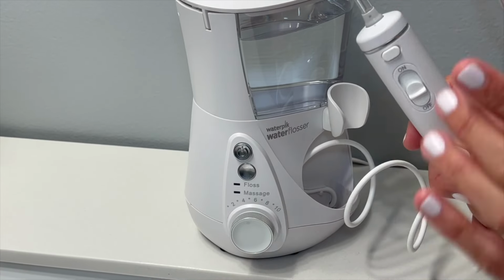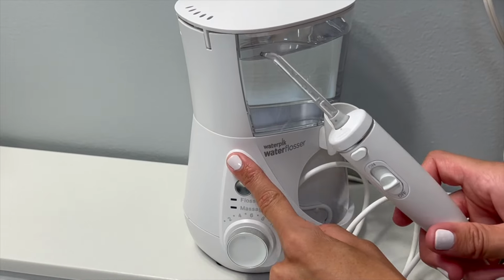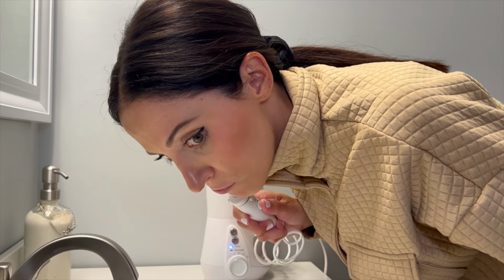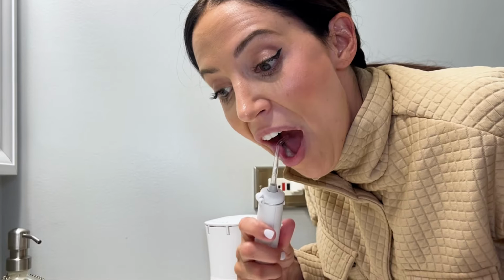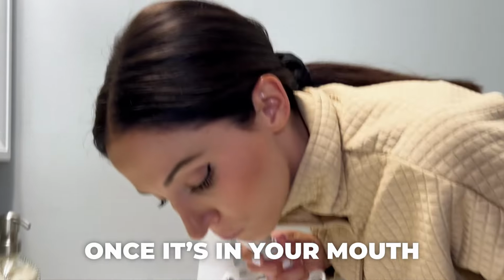Now, check to see if you have 1 or 2 on buttons. I like the units that have 2 on buttons just because it's easier to stay less messy. Like if it has an on button on the unit and also another one on the handle itself. Because this way you could turn the unit on right away and the water flow won't start yet. Then you have time to lean over the sink and get situated with the tip that is not flowing water in your mouth yet. Then once you're ready and the tip is inserted into your mouth, press the on button on your handle while keeping your lips pursed like you're about to kiss someone. There you go. And then you press the on once it's in your mouth.